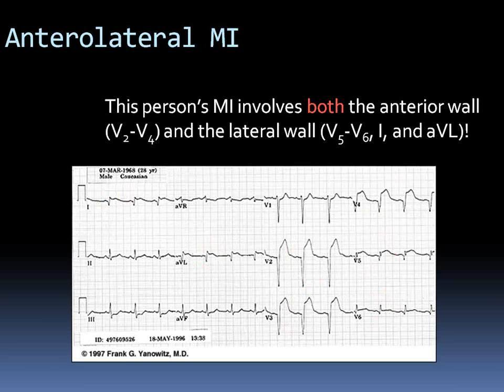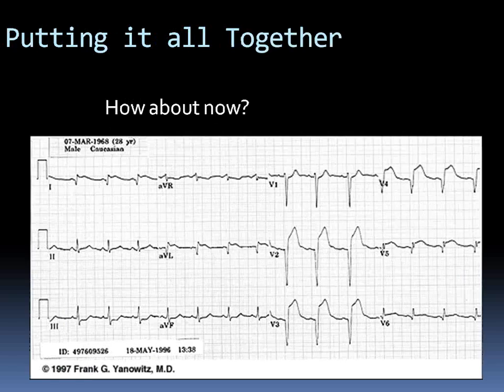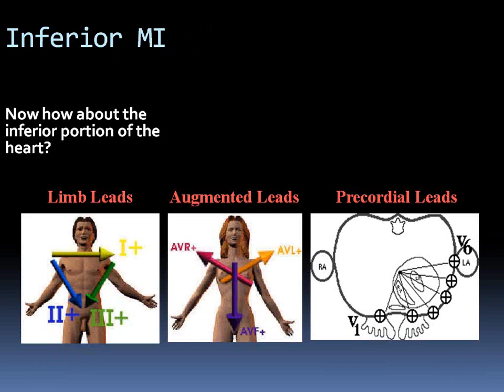Okay. So do you guys gather ECG strips, like when you guys are in the field or when you guys are seeing patients? Do you guys have a collection of ECG strips that are confusing to you, or those strips you want to discuss? Actually, the strips are available in the patient's files, so we could actually have a look at them in the patient files, yes. Okay, that's fine. So let me just go back to heart blocks again.